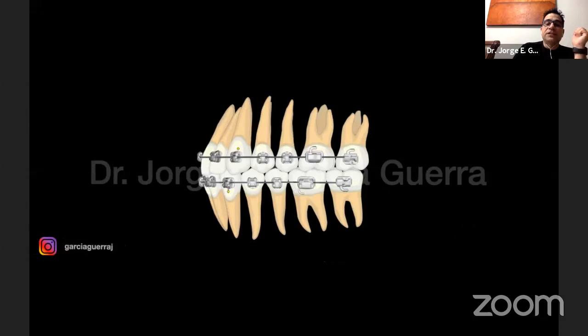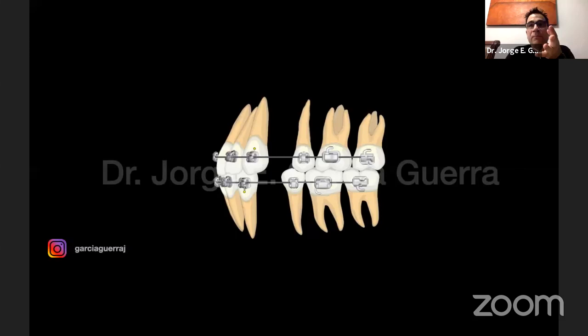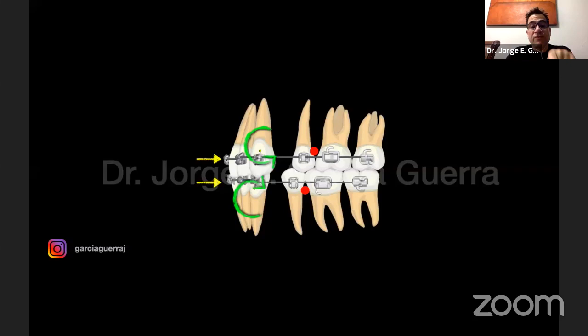Now, a typical situation that we have in cases with bicuspid extractions: when we start the retraction, we're going to have this situation on the front, in our incisors. When we have an overcorrection of the overbite and we continue to close the spaces, we're going to start opening the bites on the lateral side, on the buccal side. So it's very important to control the torque when we're closing spaces.